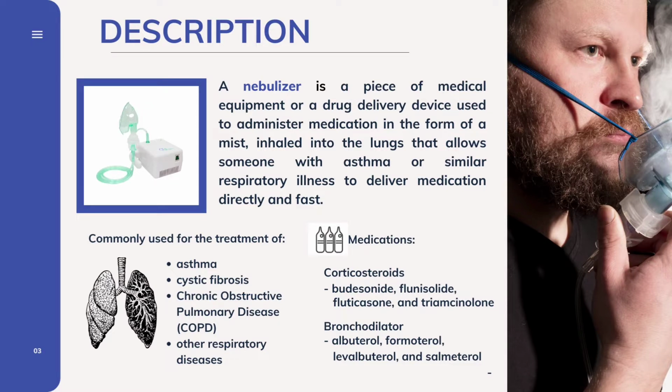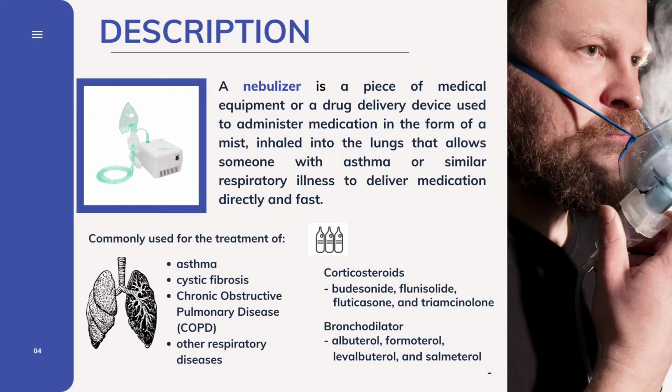Nebulizers are also helpful when a person has trouble using an asthma inhaler or needs a large dose of an inhaled medication. This is because inhalers require a specific technique to administer asthma medication to the lungs effectively. Nebulizers are considered to be a bit easier to use because you simply inhale medication directly. Nebulized therapy is often called a breathing treatment.